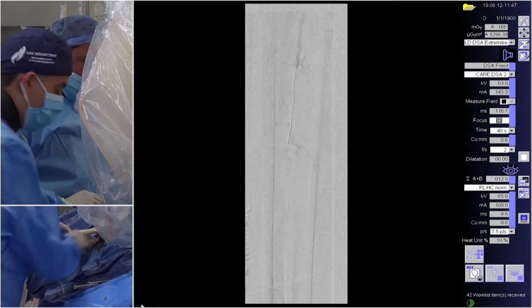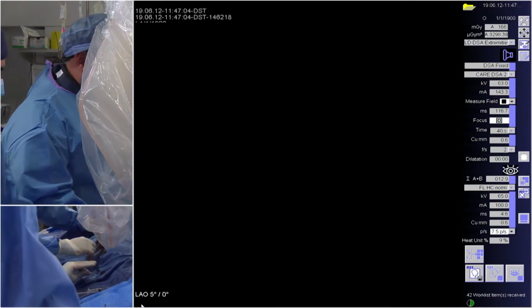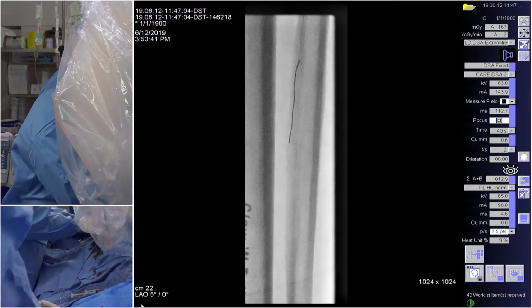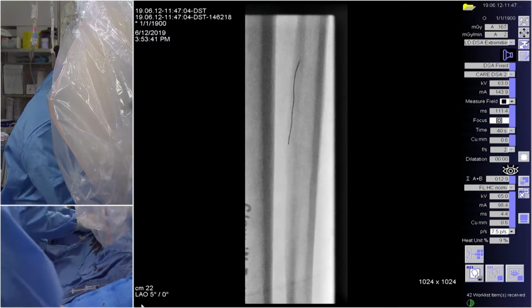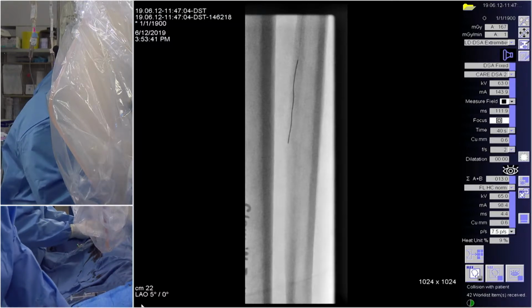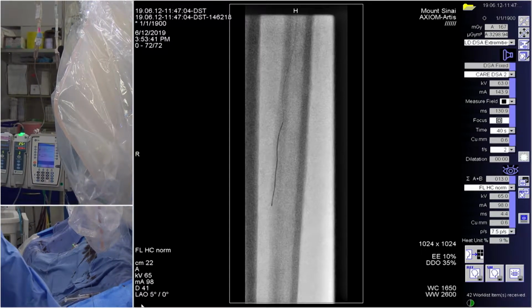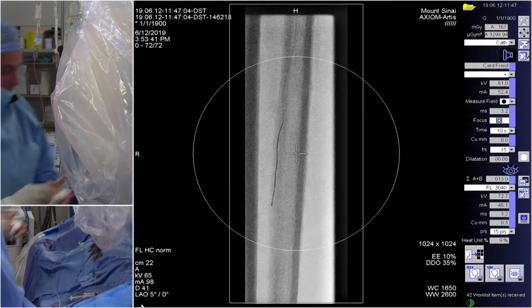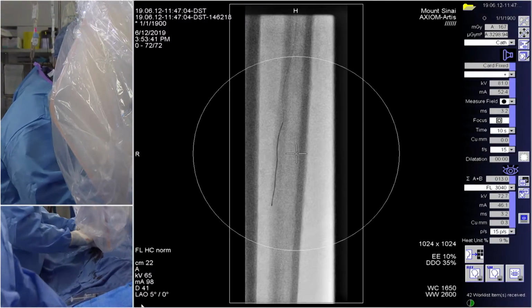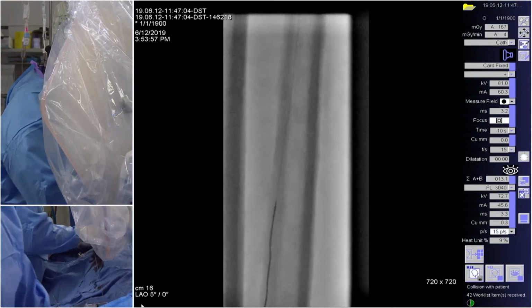And so what we've also sometimes had to do is take out the wire here and then put a CSI Wiper wire down, and then maybe run a CSI through here, because I don't think this is going to cross. We had a similar case we did for ARCH with George Crescent, and this was a similar kind of case that really made life very, very difficult for us, where we were not able to get anything done, although the wire went. So I think you guys need to rail me here, guys.